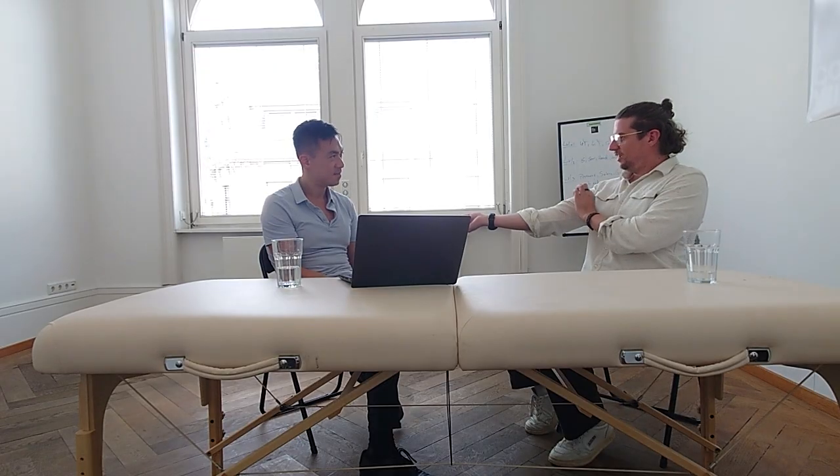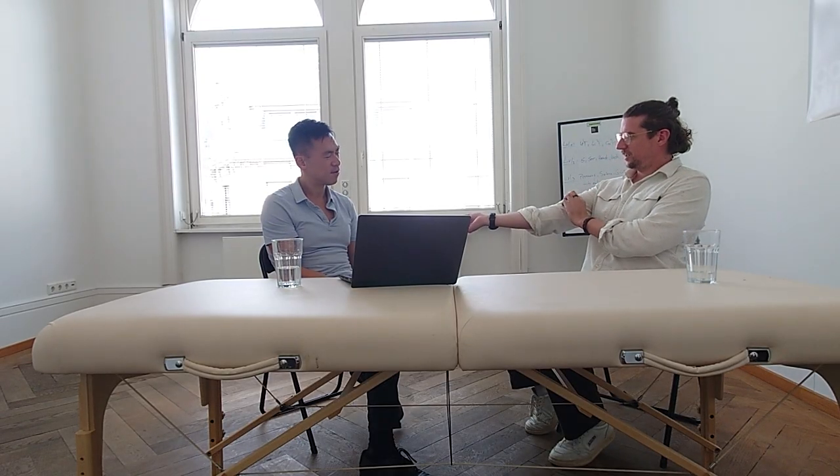Let's put the size aside, because in this case, always remember what creates the size of the muscle. What we measure is the electricity in between every fiber, and then you have the summation. I guess it's also explained in the first podcast, our webinar. So you have a summation of all the motor units, and in a muscle which is bigger, you also have more fat and more water.